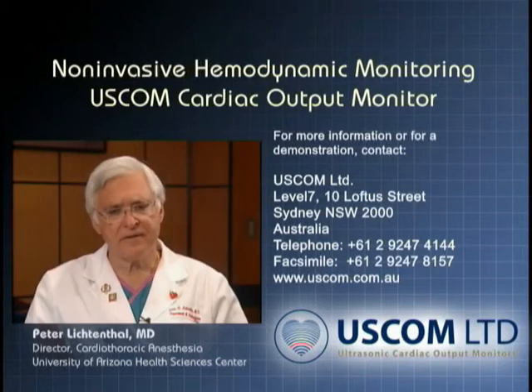USCOM is the only truly accurate non-invasive system.